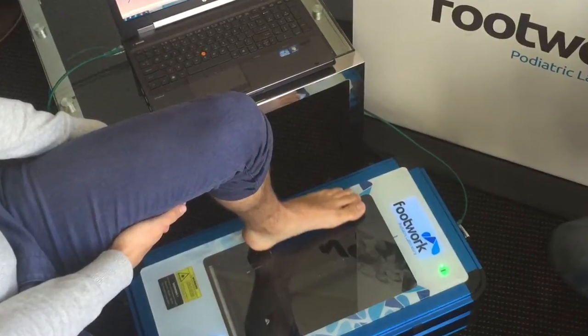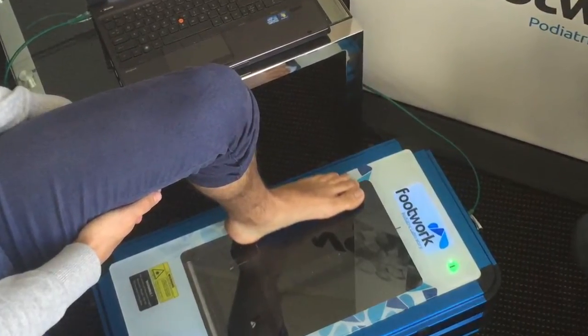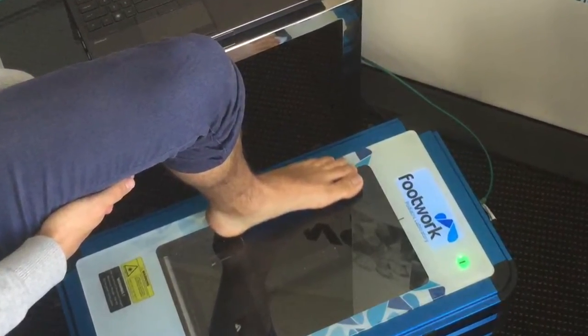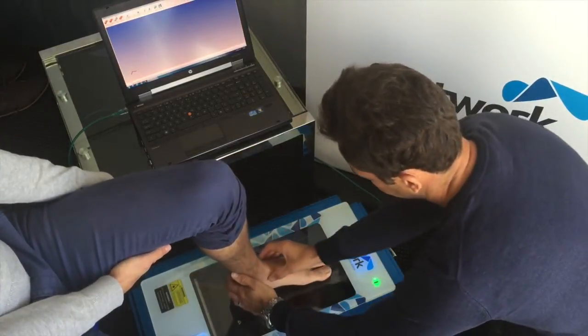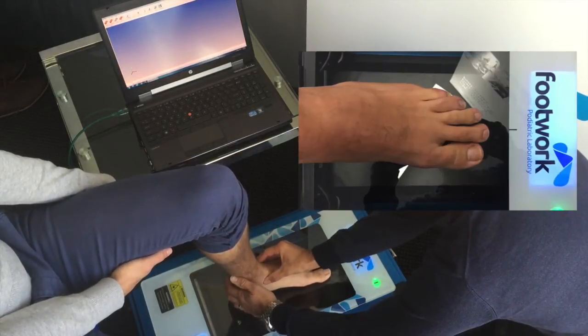Okay, so the key points when taking your scan. Firstly, reduce any direct light reflecting off the scanner. Then align the foot with the midline of the scanner and the second toe.